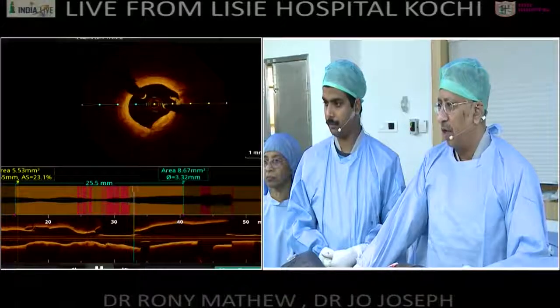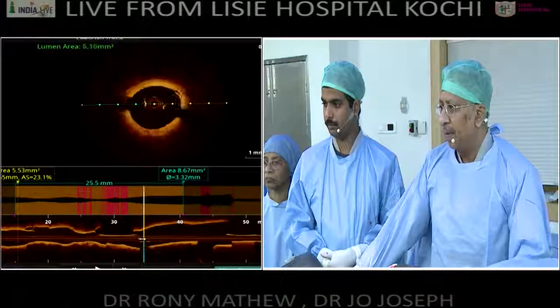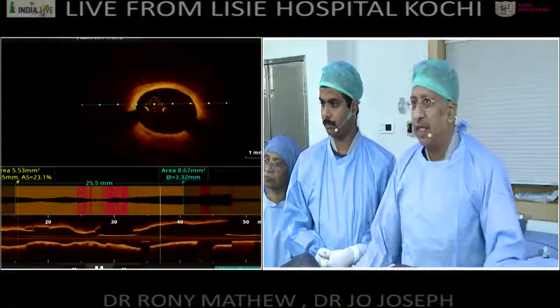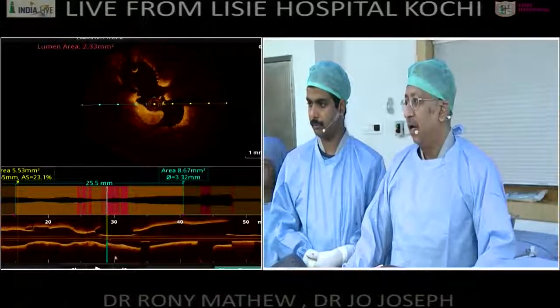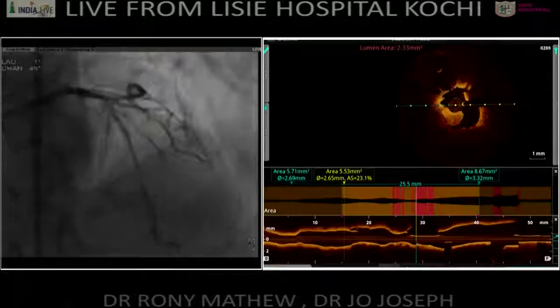But I want you to concentrate on the bifurcation point of the diagonal, which I have crushed with a diagonal stent. And once I crushed this with a diagonal stent, I recrossed. When you recross this, you must recross from the proximal strut, unlike in provisional stenting where you take the distal strut.